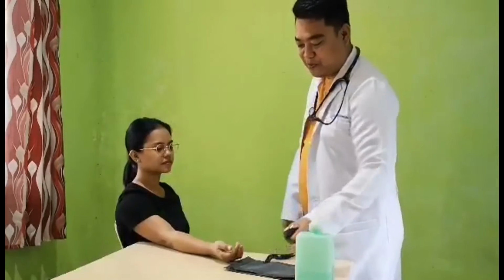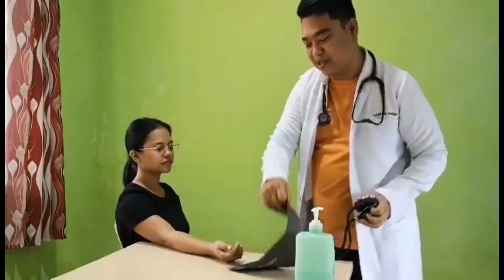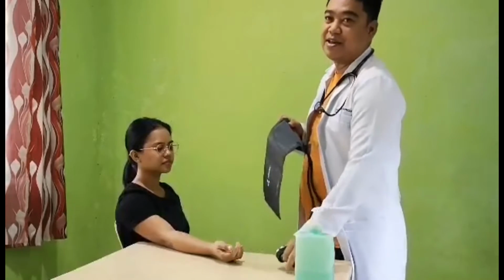Okay, in this case, I am going to monitor the patient's BP. Our patient is a female and 22 years old. Now, going to our procedure, I am going to use an appropriate cuff, which is an adult cuff, in monitoring the BP of my patient. Now, this is the sphygmomanometer.